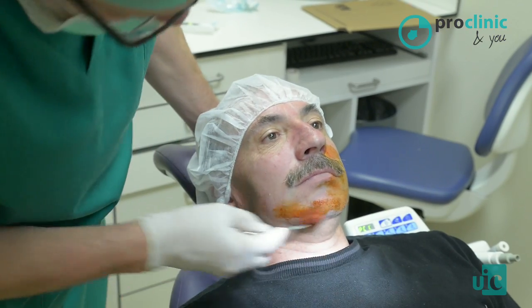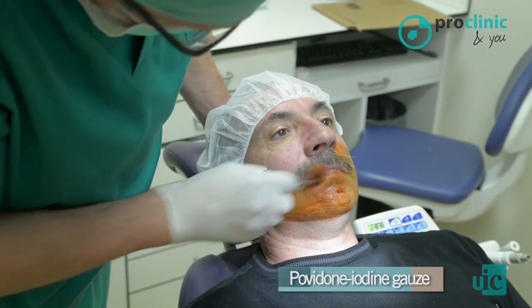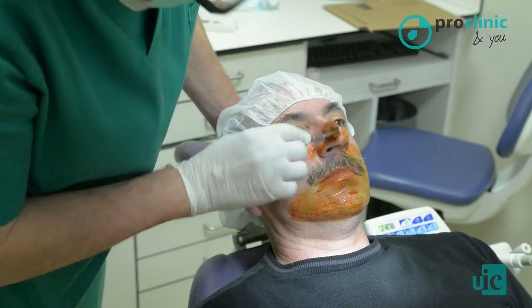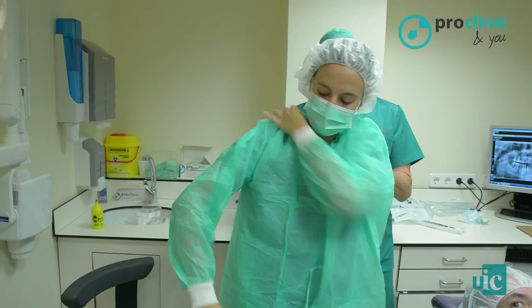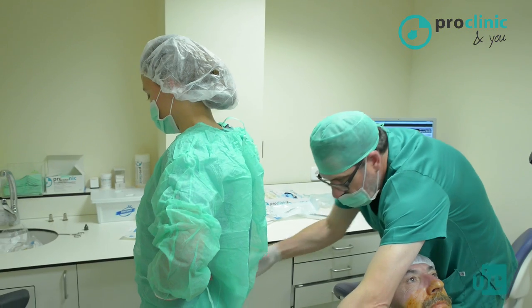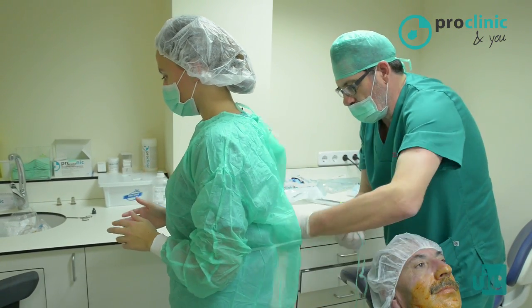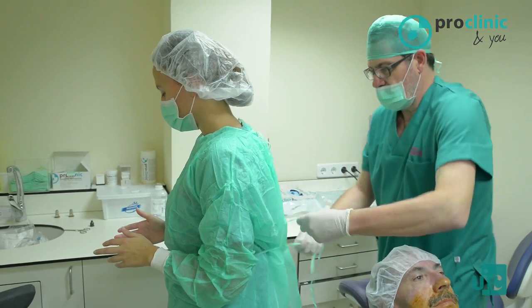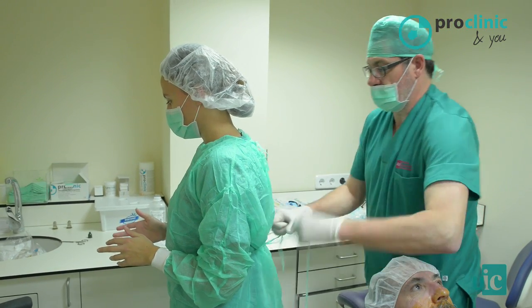To achieve a total disinfection of the skin and moustache, we use gauzes with povidone iodine. Now I am going to tie her surgical gown behind. I cannot touch her hands, just the ends of the cords. The back is not considered sterile, so I can touch it, but the front part is sterile, from the trunk up to the neck.